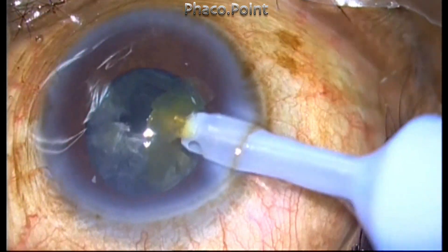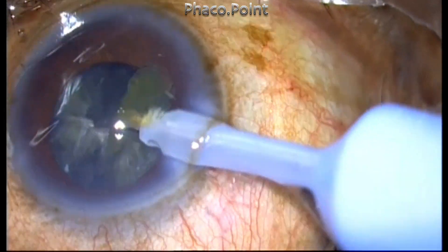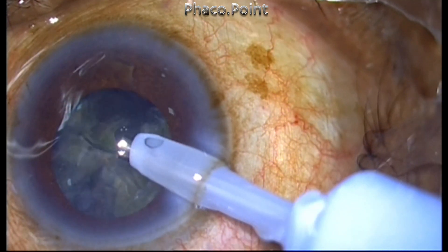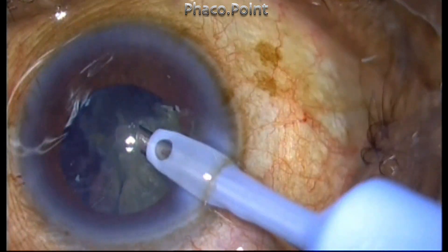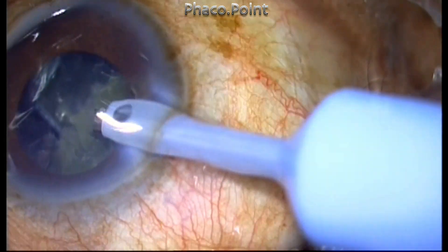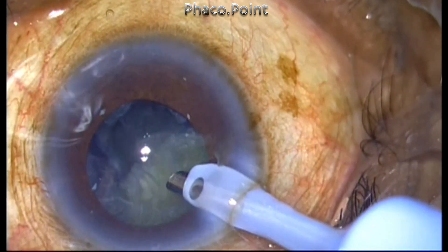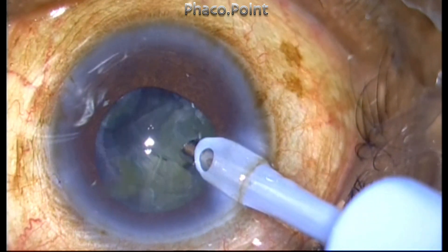It's also important to make sure that you do not move or wave the FACO handpiece too much within the anterior chamber — it should be kept steady. The only thing you should do is swivel the FACO handpiece slightly to change the direction of the bevel, so that the bevel is always facing in the direction of the piece that has to be attracted and brought towards the FACO tip.